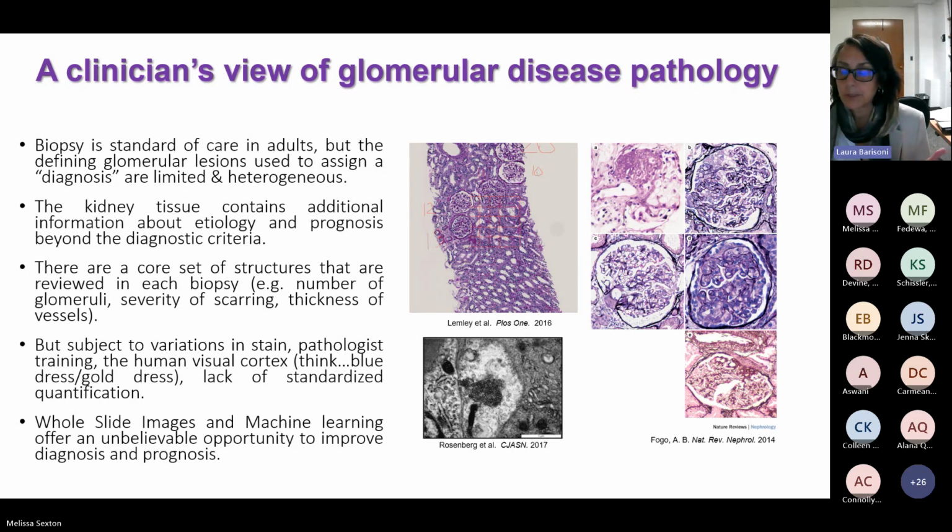And so everybody focuses on the glomerulus, but in reality, the glomerulus is not just floating in the air. It's floating in tubules and interstitium, and they can be inflamed and they can be scarred. So all these components are important. And the DPR allows us to place ourselves in a position where we can actually study all these elements.